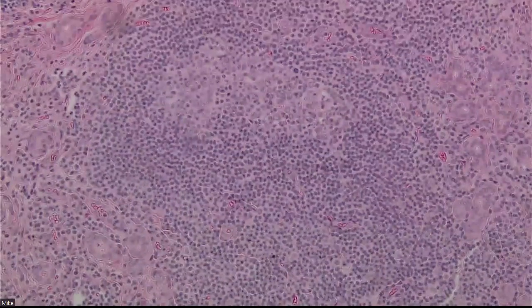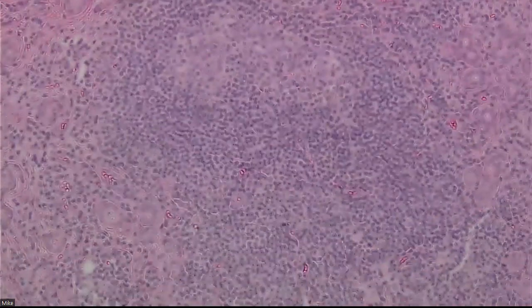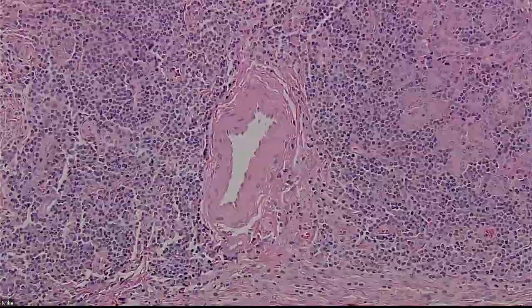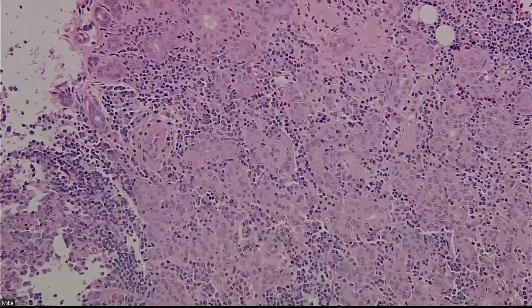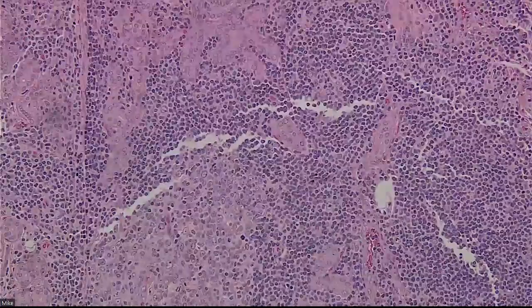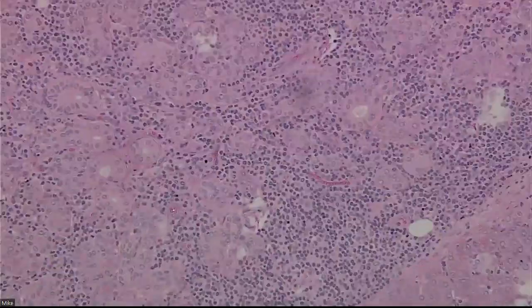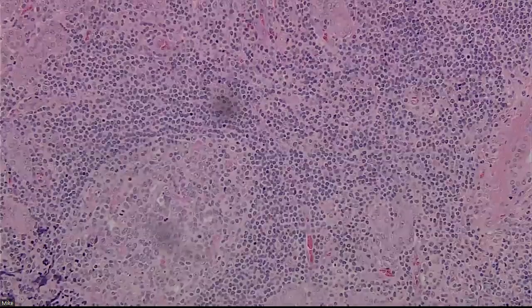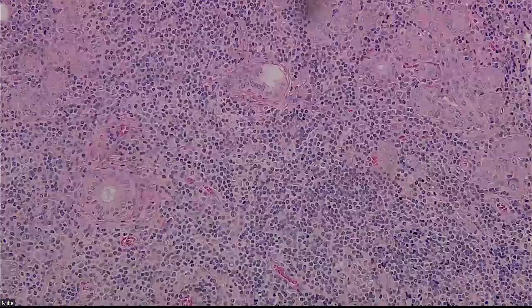are, if this was very plasma cell rich, what would you think about? IgG4 related sclerosing disease. So you may have read about these in the books as Kuttner tumors. These quote unquote Kuttner tumors are basically now known to be IgG4 related sclerosing sialadenitis. So if you see sclerosis and plasma cells, you may want to throw an IgG4 on there. Those are the main things in your differential. Otherwise, this is a non-specific sialadenitis.